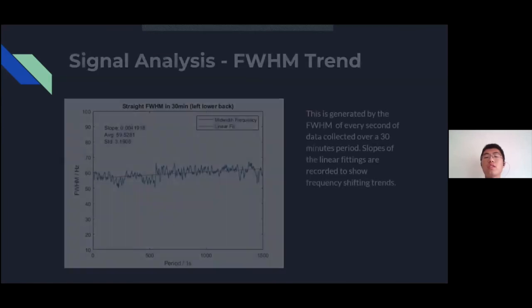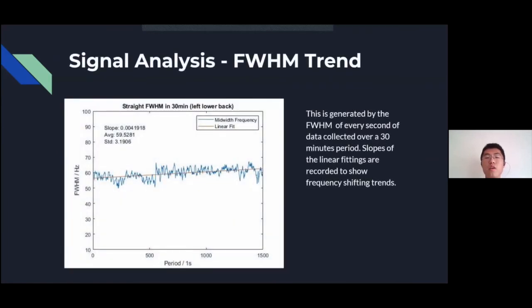Now let's see the result. This is a graph after we plot out all the FWHM in the 30 minutes period. And the slopes of the linear fitting are recorded to show frequency shifting trends. From here, you can see the shifting trends or linear fitting, the slope of it is kind of positive, which means muscle doesn't get really fatigued in this period of time.